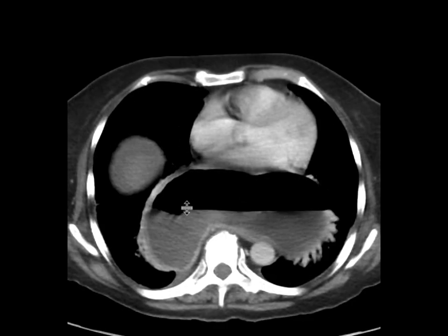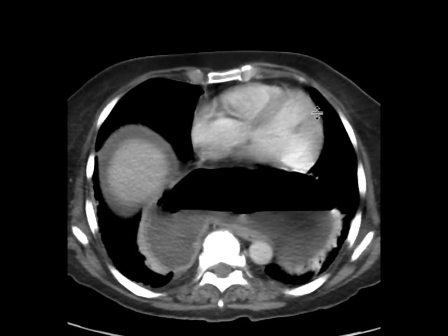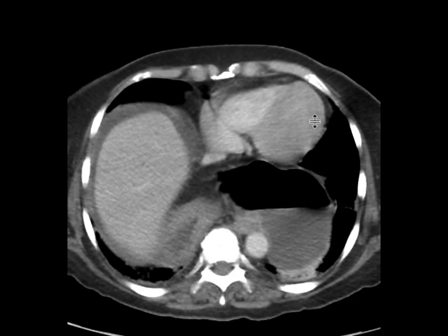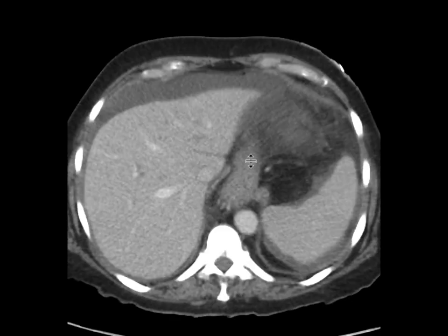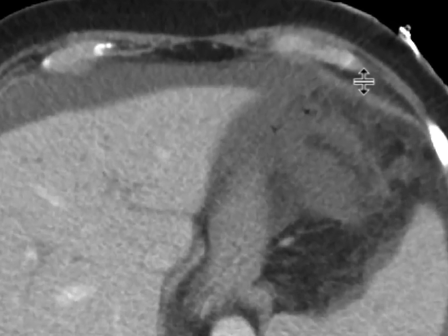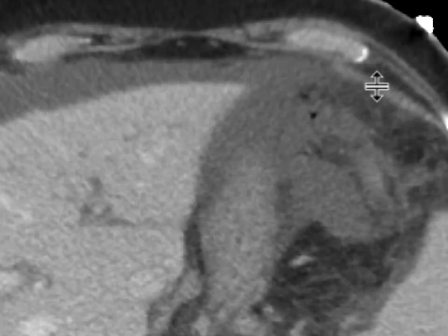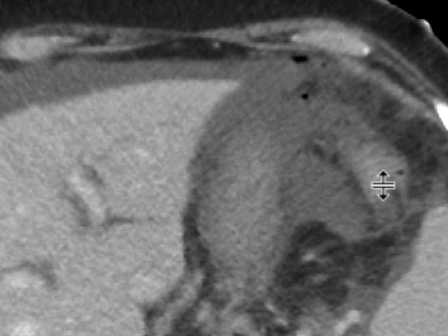You can immediately see this large hiatal hernia with the majority of the stomach in the chest. As we go towards the distal aspect of the stomach, we can start to see that there's a fair amount of fluid in the peritoneal cavity, as well as a few tiny foci of pneumoperitoneum, and so we're suspicious for a perforated viscus.